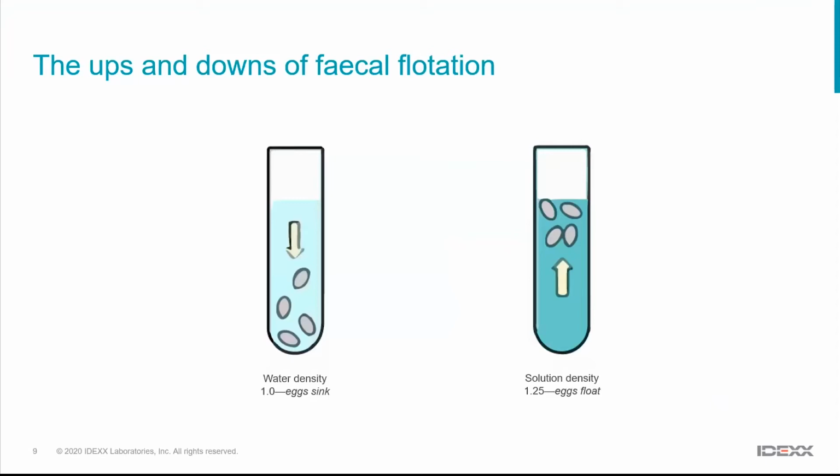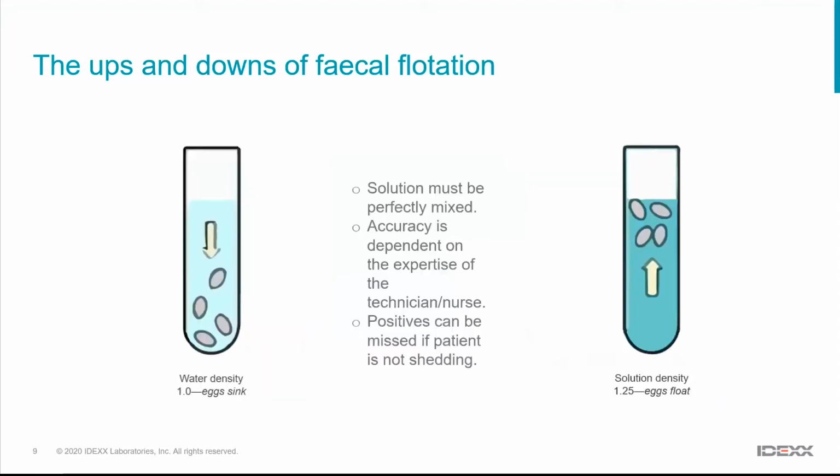And we've got to get the right concentration of solution. If the density is too low, they sink. We need to be able to get the eggs to float, but not at a density that's going to damage the eggs. So the solution has to be mixed well. The accuracy is going to depend on the expertise of the person doing the test.